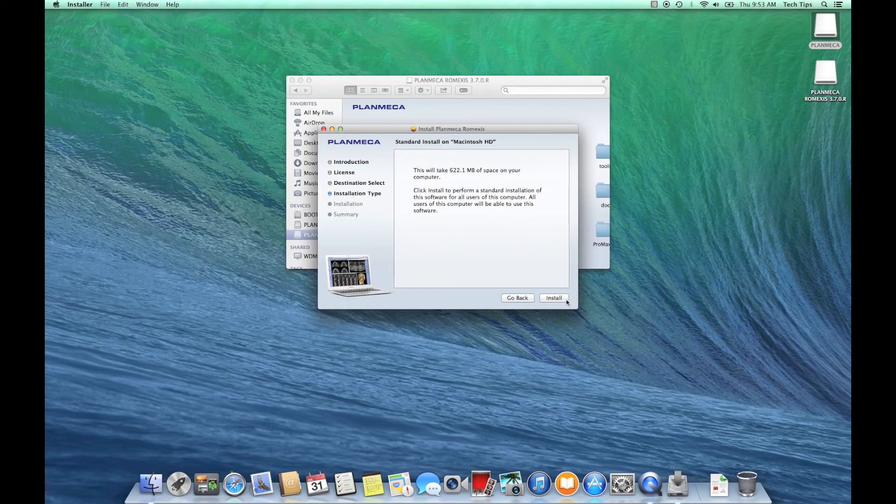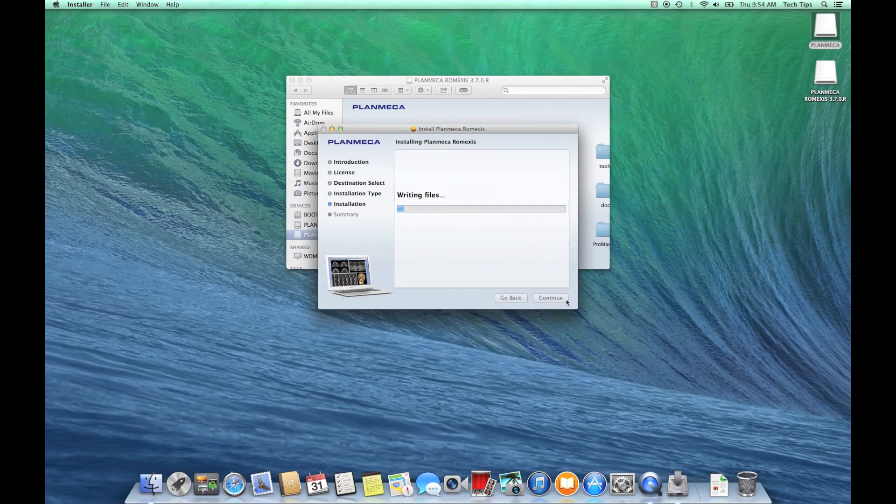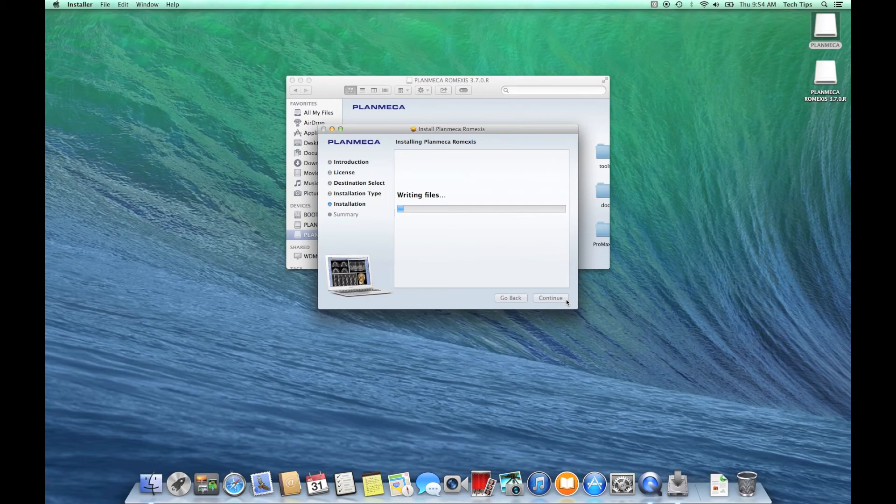of course because it's Mac, we're going to type in that password again and here we go, we're installing. I'm not going to speed this up. I want you to see and get a feel for how long this should take on a Mac. I think you'll be happily surprised that it's pretty quick compared to a Windows installation.